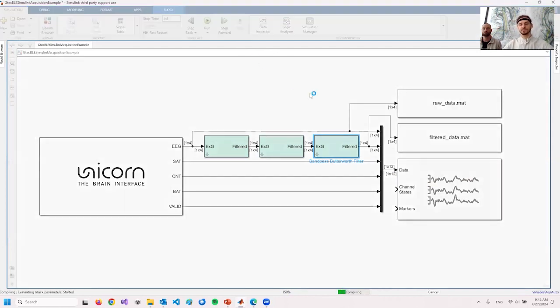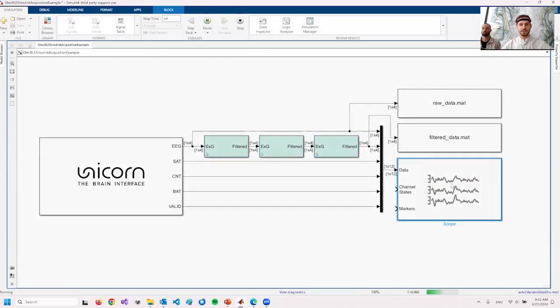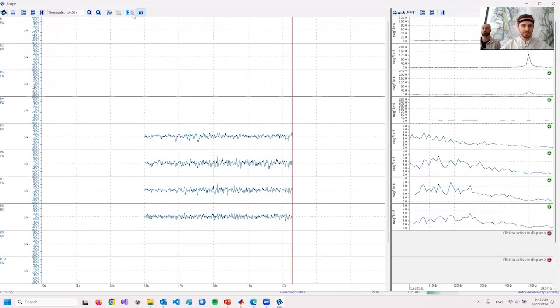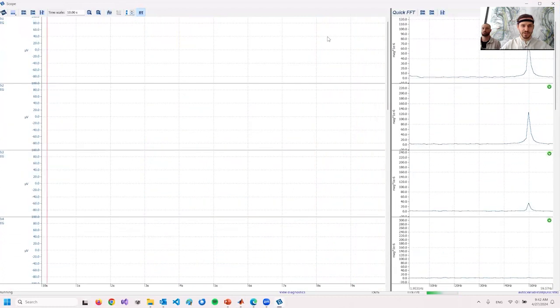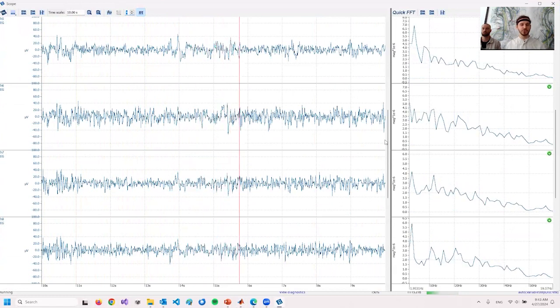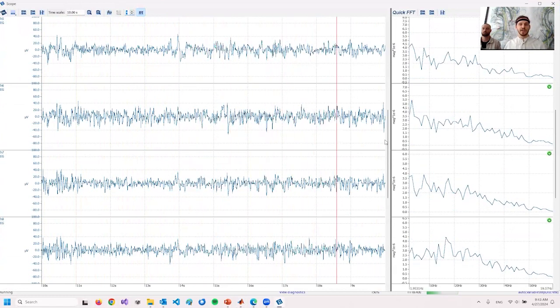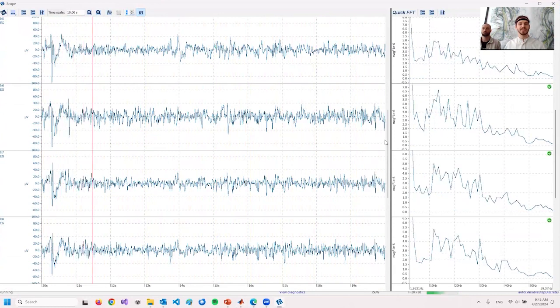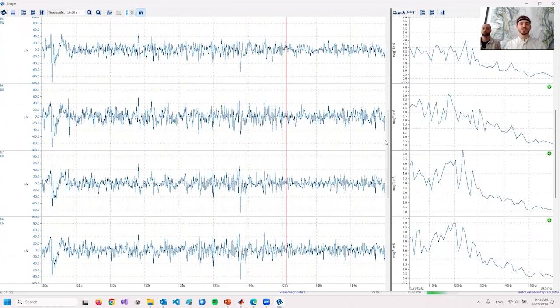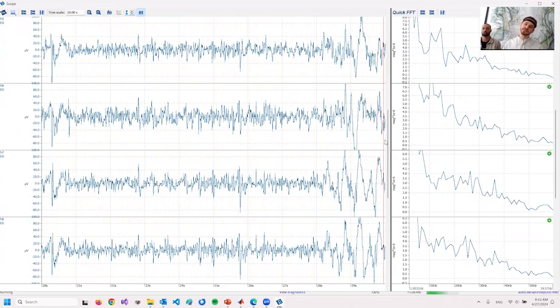Then I'm running the model. And we can see signals coming in. I want to just visualize the 4 channels that I'm acquiring. And we can see some good looking EEG data. I can also do some tests, like clenching my teeth a couple of times. That's how I would introduce some artifacts, or move my head a little bit.